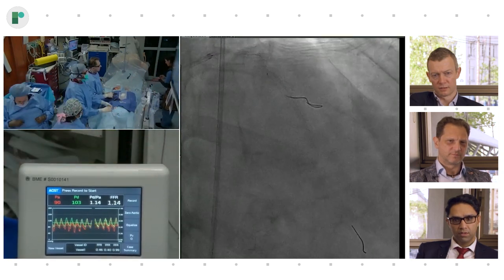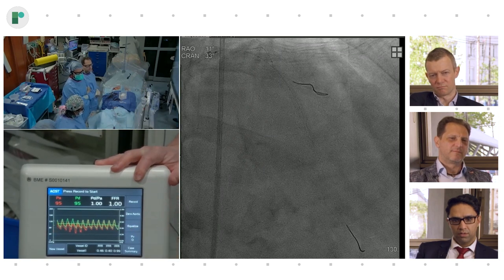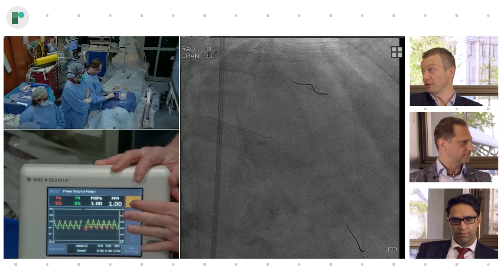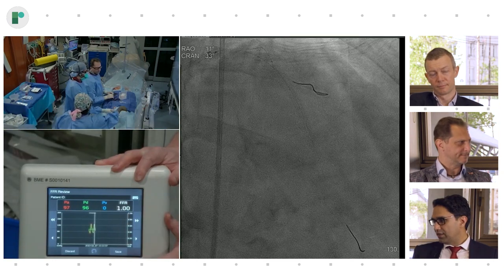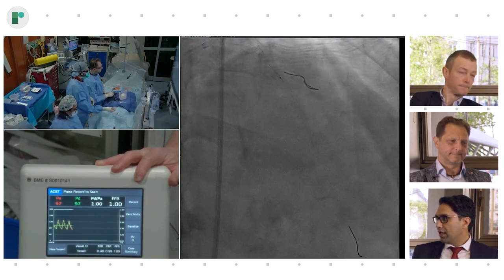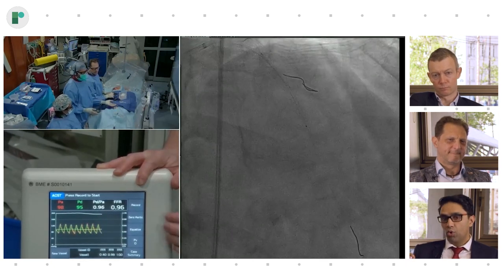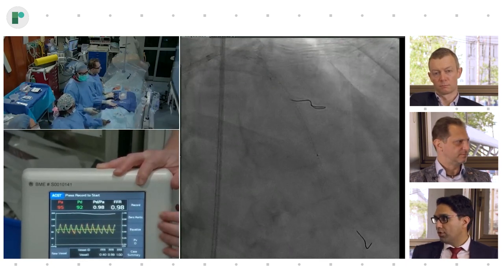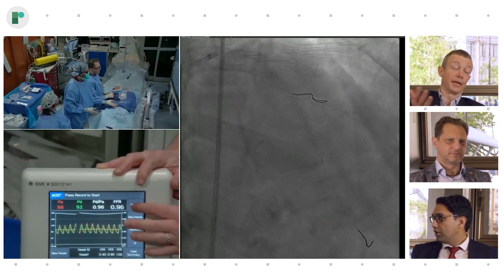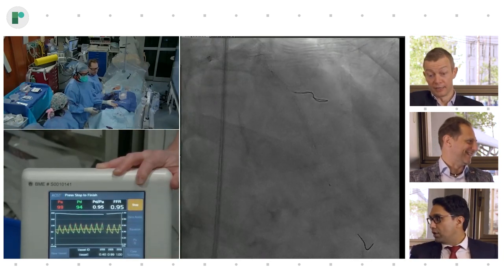Yeah, that's interesting, right? All right, let's just equalize this. But it's also difficult to interpret, right? I mean, you have no reflow per definition. Right. So the reason we did this, Joost, was to help delineate whether we have a focal distal edge flap where there would be a pressure gradient across, or if we go distally and the pressure's normal, then that excludes that. But you rely then, we think, on the non-hyperemic index? Correct. Well, there's no flow, so. Exactly. There's no flow. I agree.